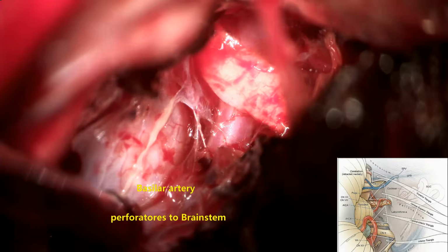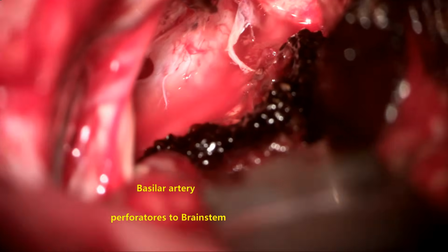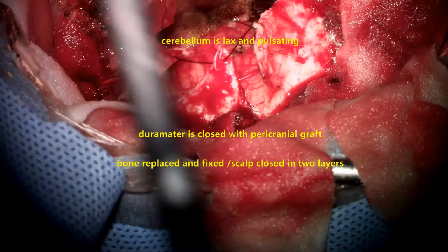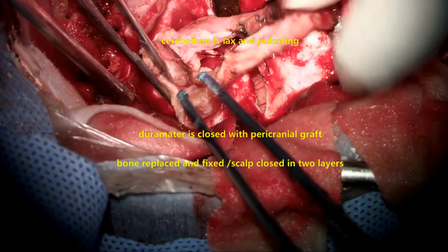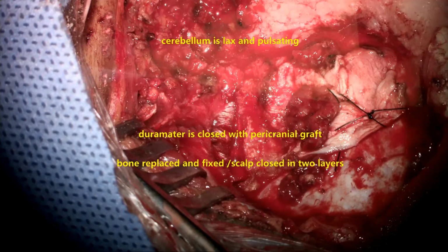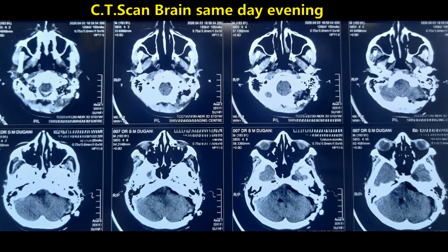We ask the anesthetist to increase the blood pressure by 30 to 40 millimeters of mercury before we close, to confirm that there is no ooze in the tumor bed. Cerebellum is lax and pulsating. Confirm the absolute hemostasis for 15 to 20 minutes. Dura mater is closed with the pericranial graft. We prefer always pericranium rather than artificial dura. Acceptance is better. Infection chances are less. Bone flap is replaced and fixed. Scalp is closed in 2 layers.